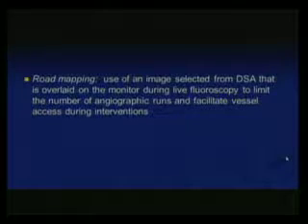And a little bit about the road mapping. This is the use of an image that is selected from the DSA. So you already done the DSA and it's overlaid on the monitor during live fluoroscopy, and this limits the number of the angiographic runs, and this facilitates access during interventions.